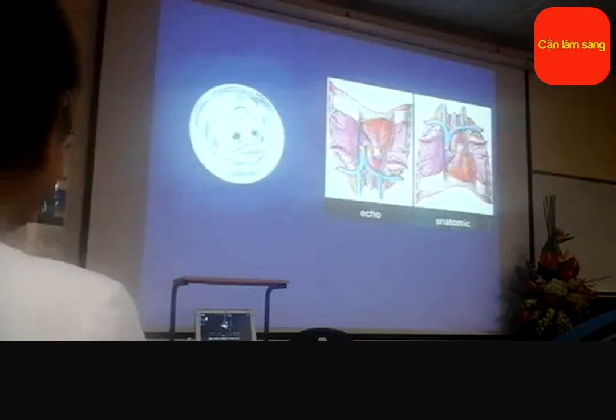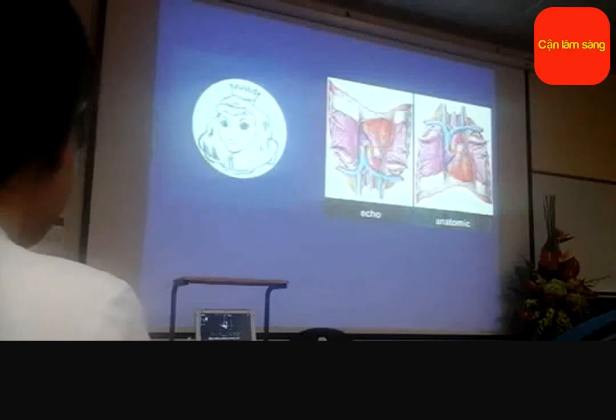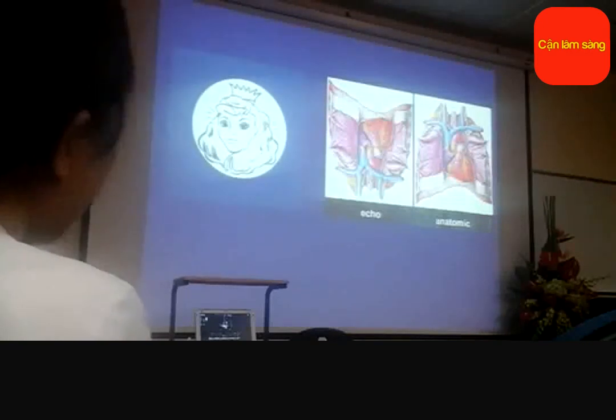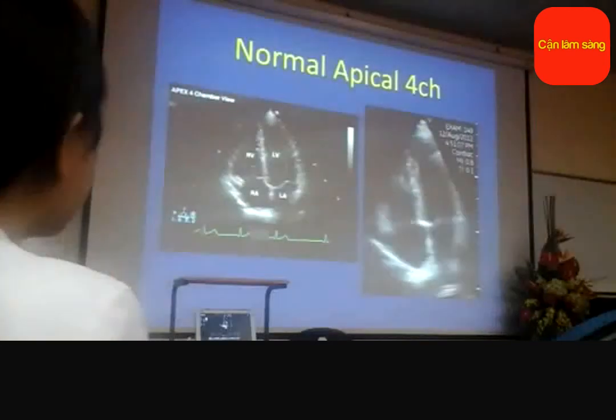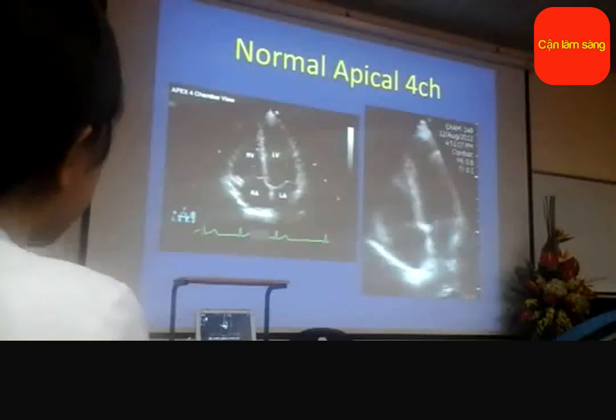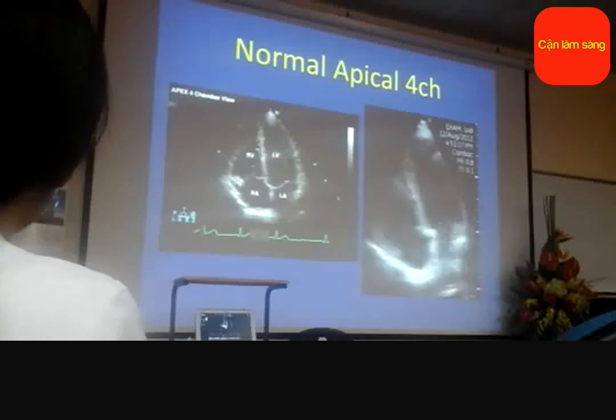So we like to turn it upside down, and it is not good. But that is what we deal with. In pediatrics, they invert the images. So pediatricians do it correctly.